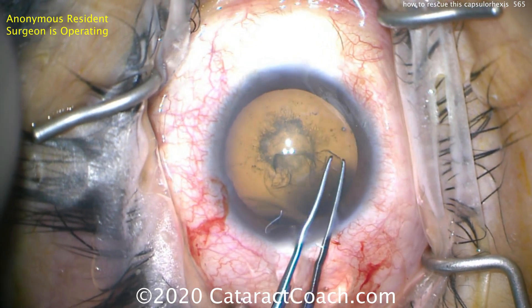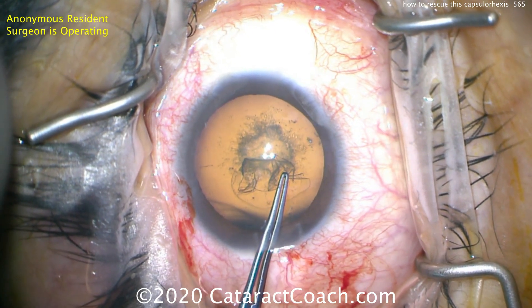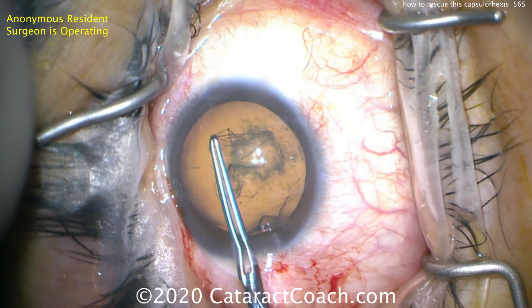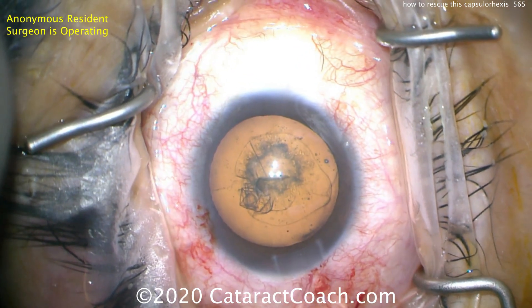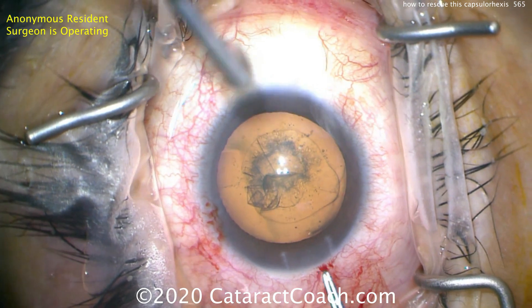The AC is shallowing — losing viscoelastic — and there it starts to run out. Here's how we rescue it: grab it and pull back, doing that little maneuver named after Brian Little. That works really well. Bring it back into position and continue the rhexis. Looking good — continue it here.